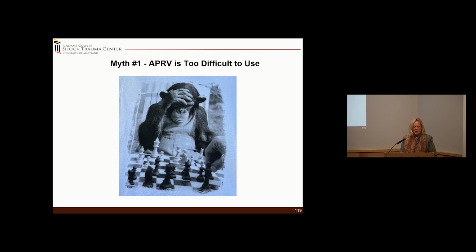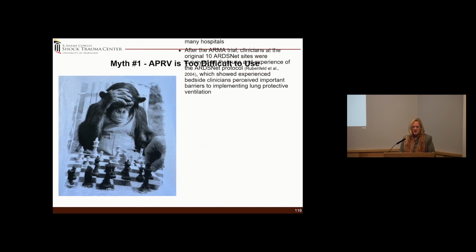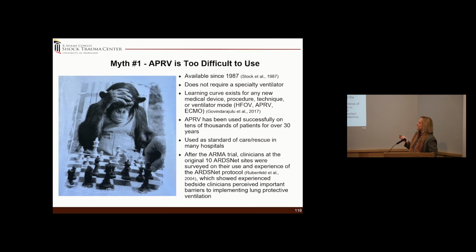So myth number 1, APRV is too difficult to use. So these are all things that we have read that have been published in papers, and if you read the actual myths and misconceptions paper, you'll see where they're cited, where some of the claims have been made. But the interesting thing is that it's been available since '87. It doesn't require a special ventilator, not like if you go on to high frequency that you have to have a special designated ventilator. It's simply another mode, another option here.